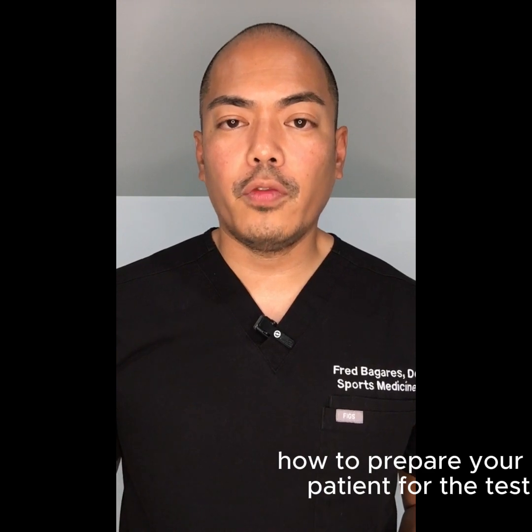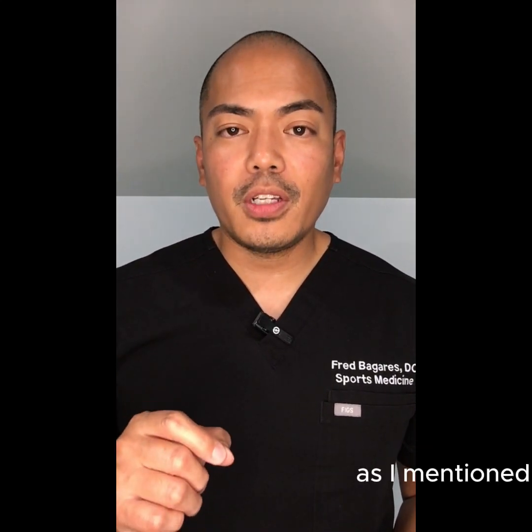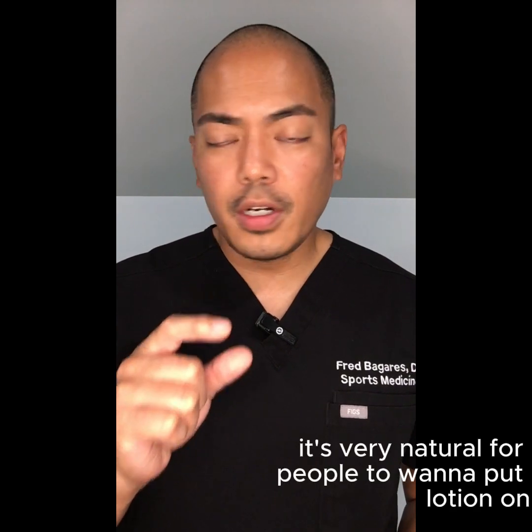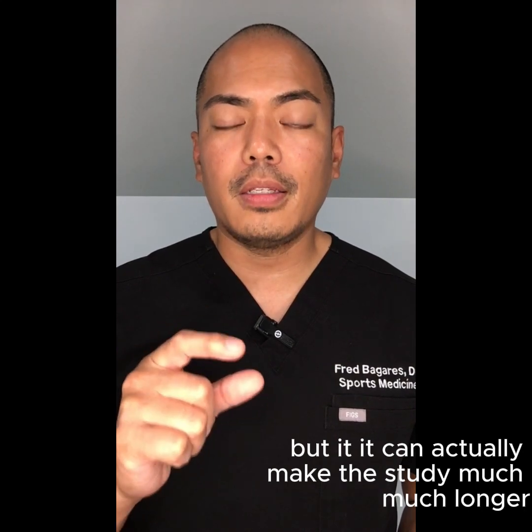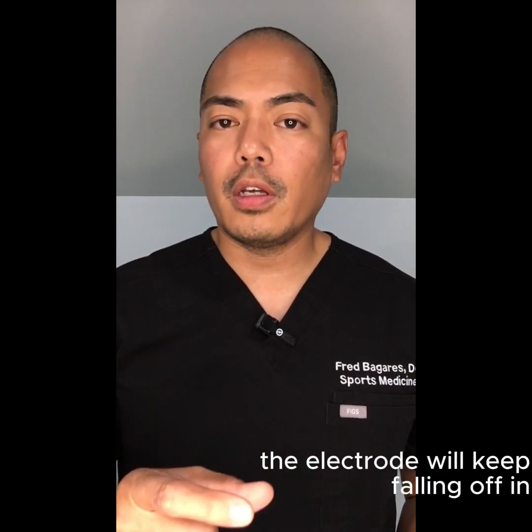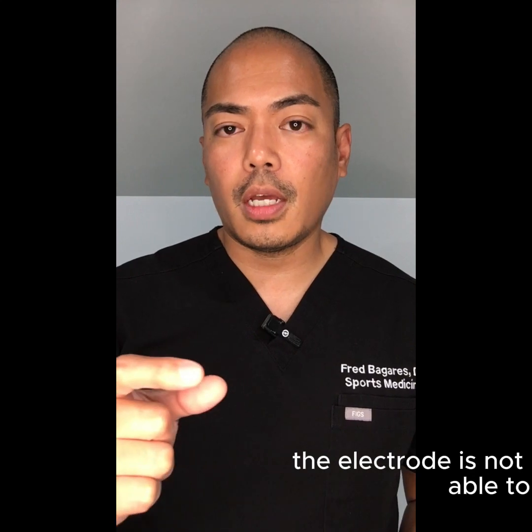How to prepare your patient for the test. The number one thing that you can tell your patient is to not wear any creams or lotions. As I mentioned, the first part of the test involves the nerve conduction study, and we use these very sticky electrodes. It's very natural for people to want to put lotion on as part of their daily routine, but it can actually make the study much longer, because if they have really well-lotioned skin, the electrode will keep falling off, and it can sometimes make the study longer. And in certain cases, it can invalidate some of the values if the electrode is not able to pick up the signal very well.